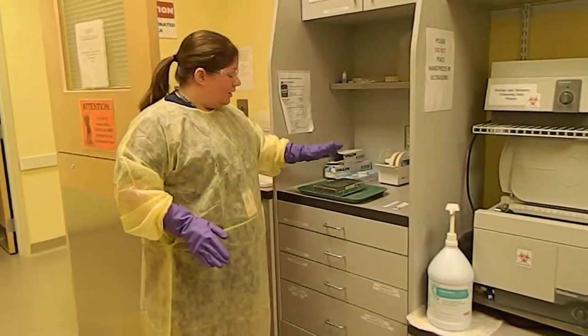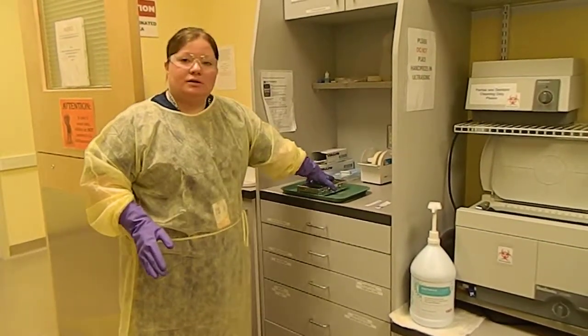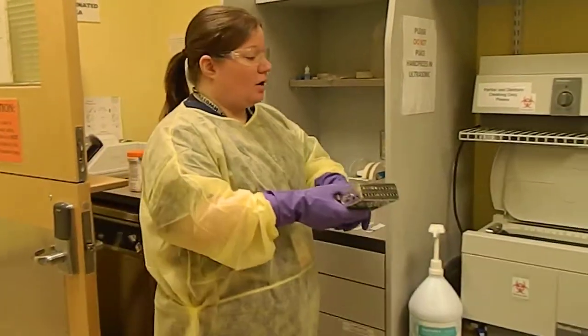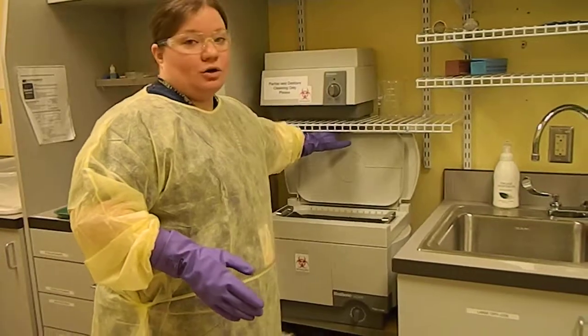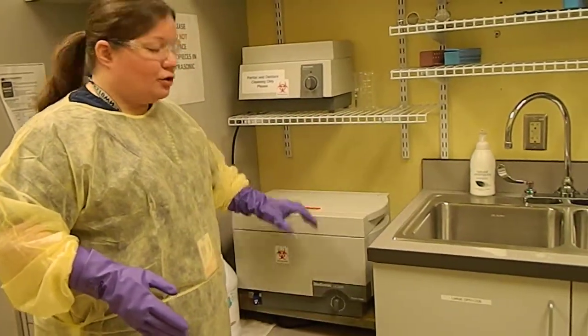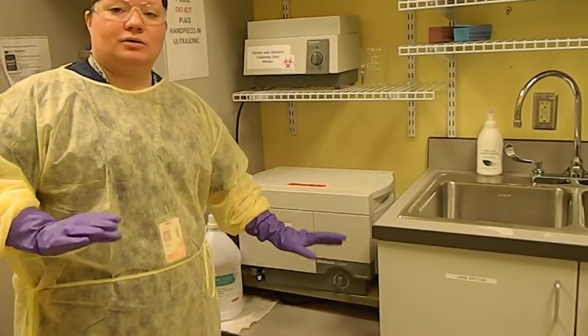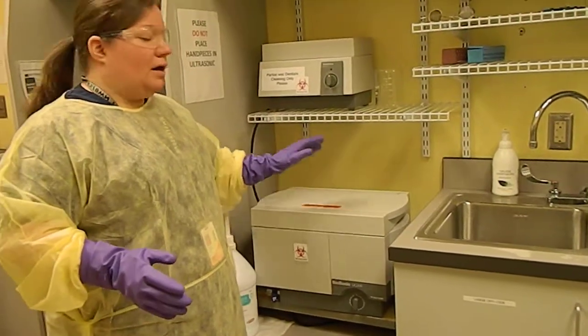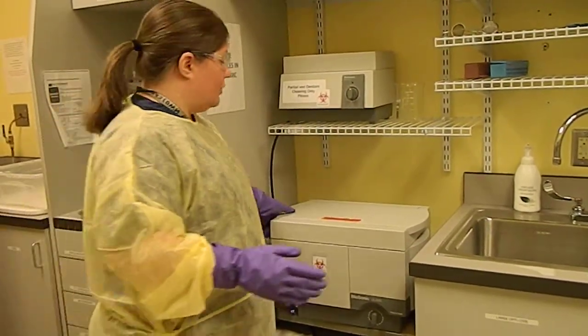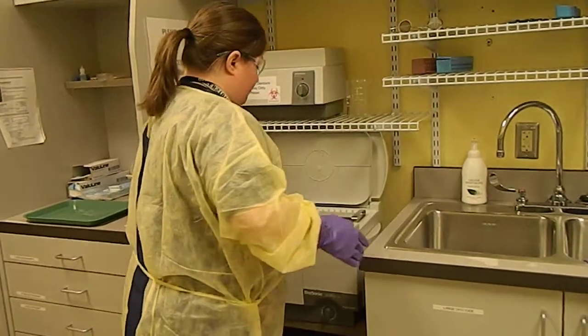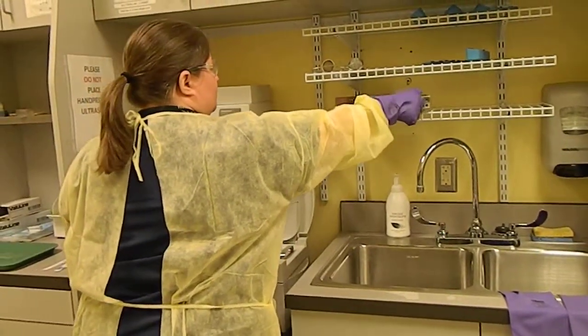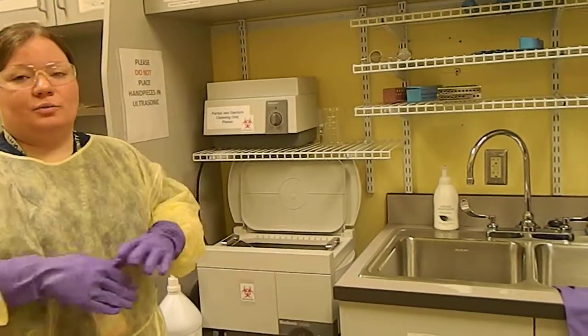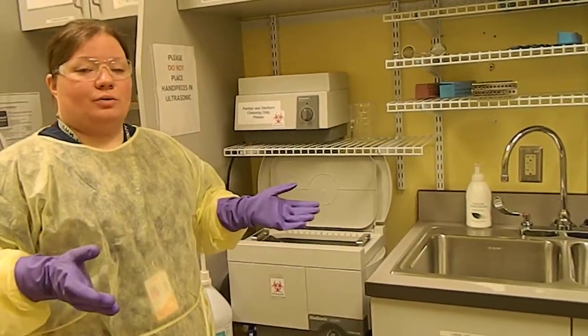My cassette is dirty so what I'm going to do is put it into the ultrasonic. It would be full of water. We're going to close the lid and turn it on and it would buzz for about 10 minutes or so. And then once it's finished we're going to take it out, set it on the drying rack, let it dry off for a few minutes and then we're going to wrap it.